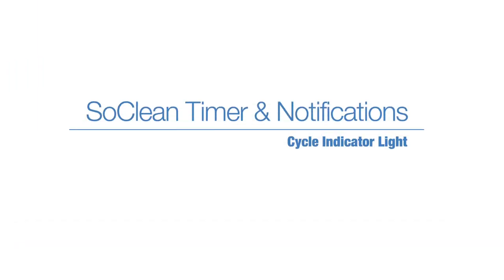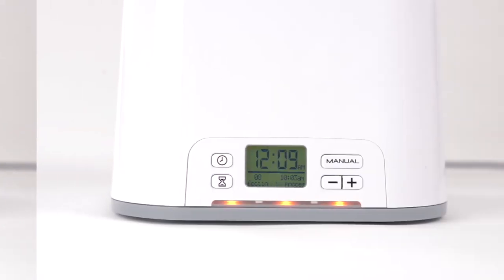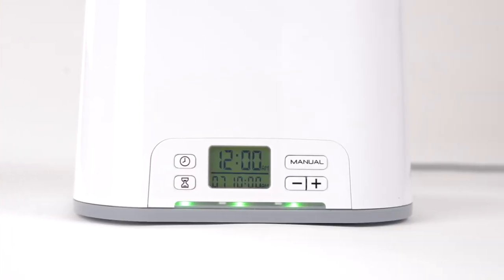Cycle indicator light: the lighted bar below the clock display indicates the status of the SoClean. Red means the SoClean is operating and generating activated oxygen. Yellow means the SoClean is in its 2-hour resting cycle. Green means the cycle has been successfully completed. The lighted display will turn off once the lid is lifted.